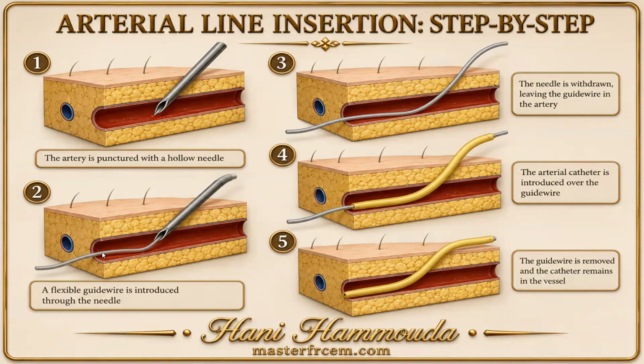Once you insert the guide wire to the safe limit, you have 5 marks. Insert up to the third mark. So the third mark will be close to the skin. Clear, doctor? Yeah. And number three, remove the needle, keep the guide wire.